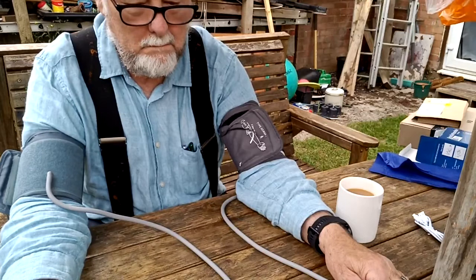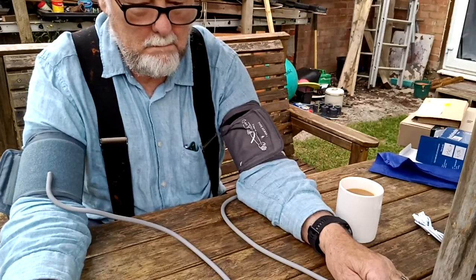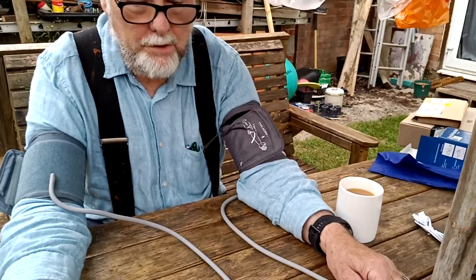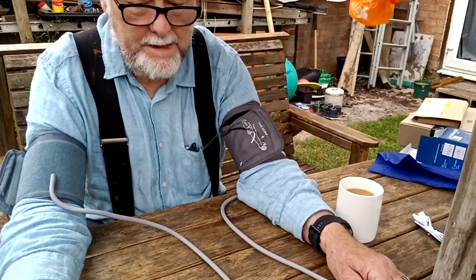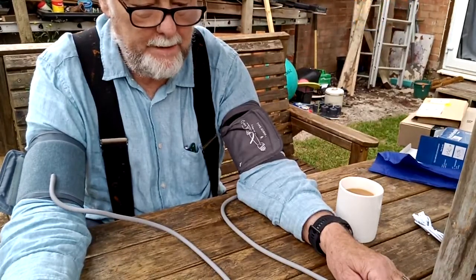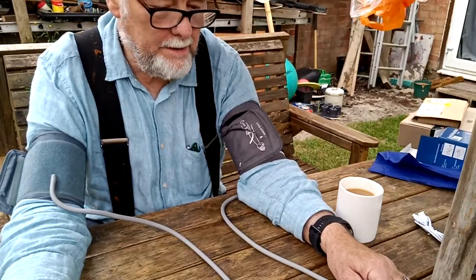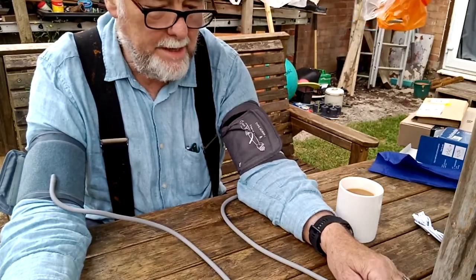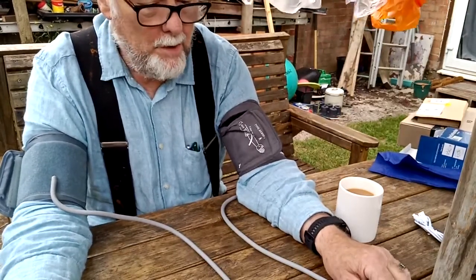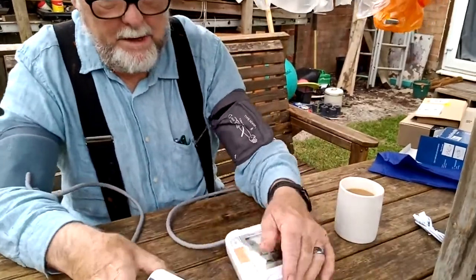Now I've clicked out a bit of the inflating time, and I'll do the same to the deflating time. So the new one's a little quicker than the old one. It's come up with 142/92 with a heart rate of 97. And this one's come up with 139/98 with a heart rate of 95. So they're both quite close to each other, certainly within the limits of measurement accuracy.